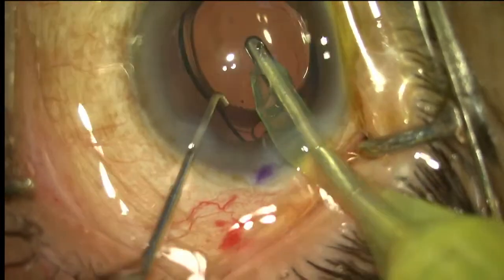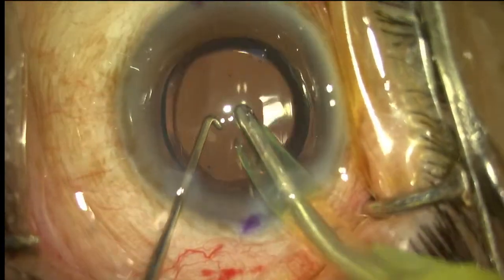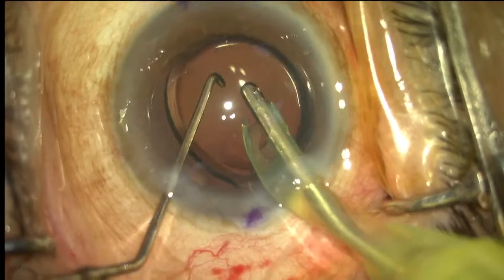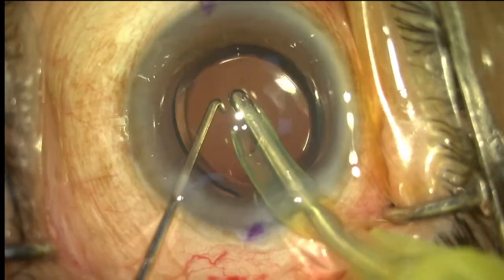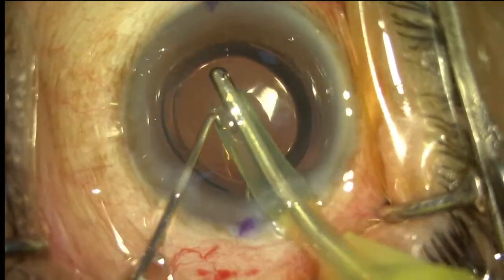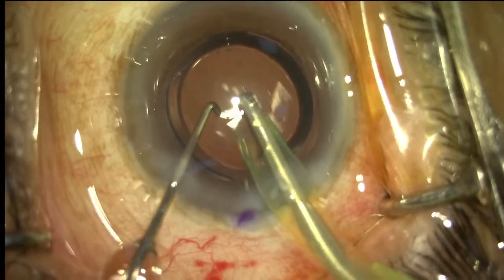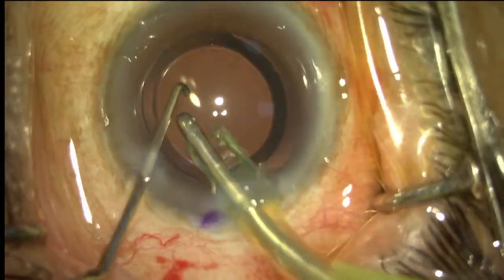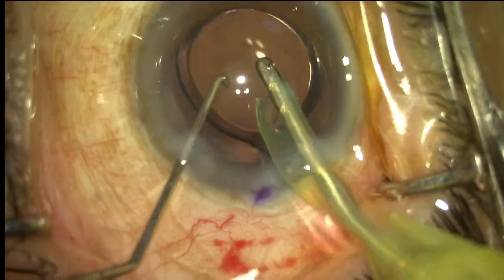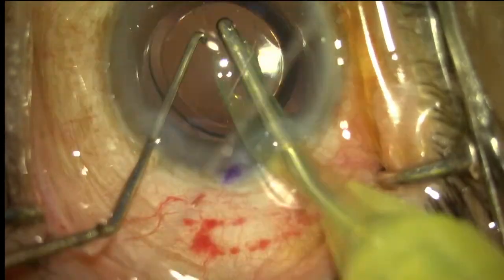Complete viscoelastic removal is a must. This iHands Toric 2 platform is really good. They have changed the haptics a little bit, so there is a frosting of the margin of the haptics along with the square edge transition, and now the rotational stability of this IOL is really good. Patients with the iHands toric are almost 6/6 the very next day, and I haven't seen any rotational instability with this lens to date.